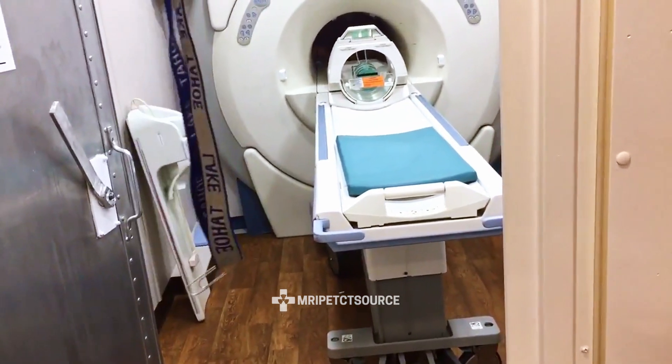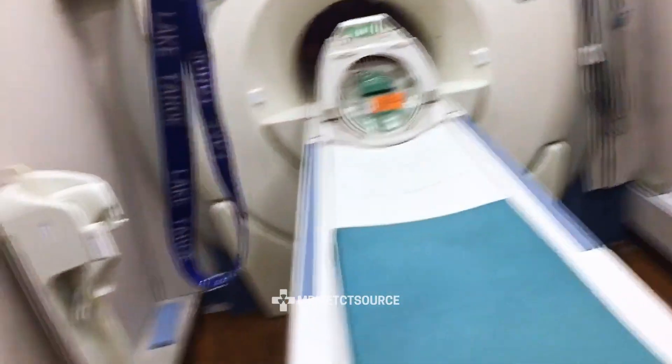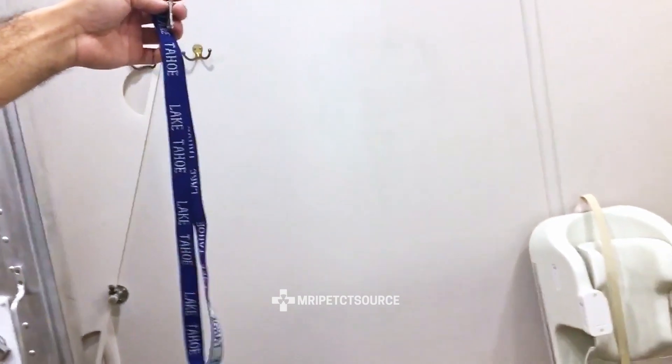We're just walking into the MRI room now. We're about eight feet away from the bore. I'm going to get on this side angle so you can actually see the pull as I'm getting closer.